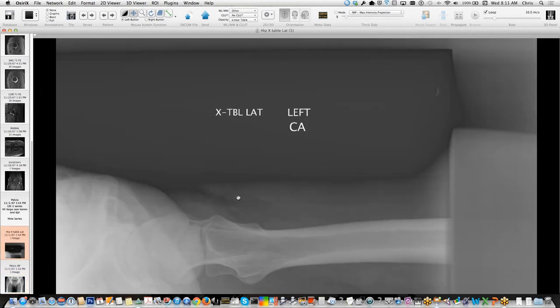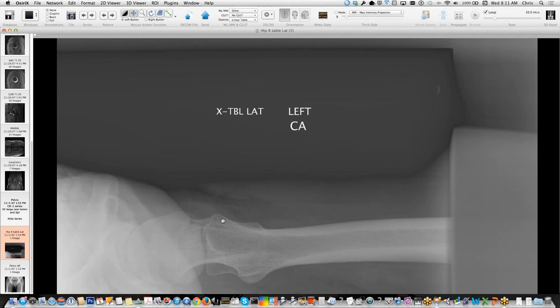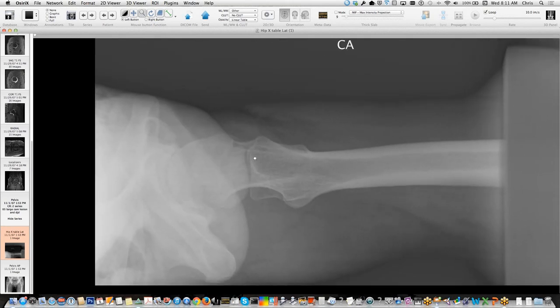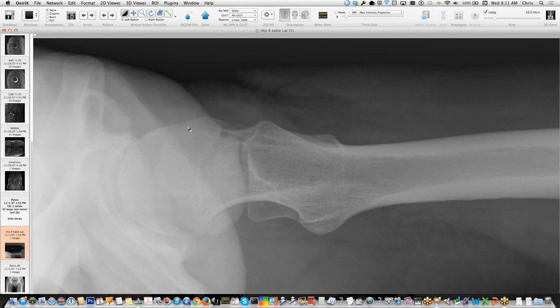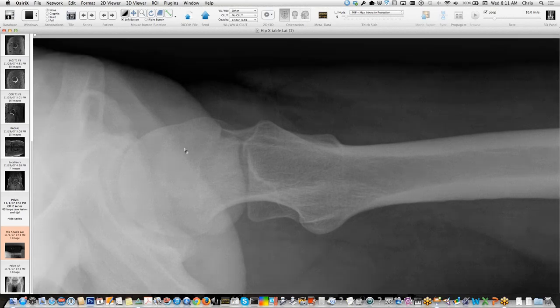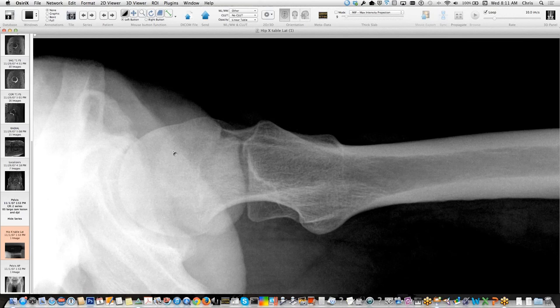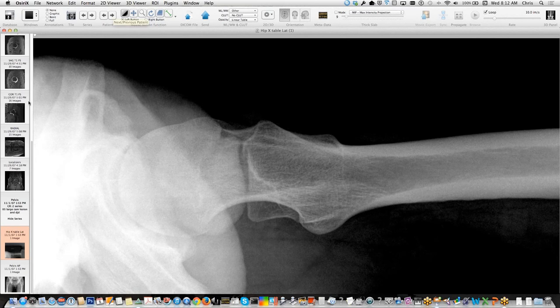Lateral views are relevant for FAI assessment too. The orthopedic surgeon who does hip surgery here gets bilateral laterals for all new patients to assess symmetry. On this true lateral, you can see a nice posterior head-neck junction concavity, but anteriorly there's a large bony prominence — a cam bump associated with cam-type impingement. On these lateral views, you can also try to assess the articular cartilage space anteriorly and posteriorly to look for arthritis.